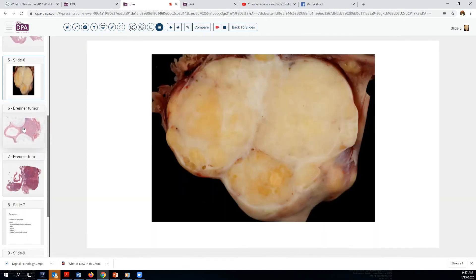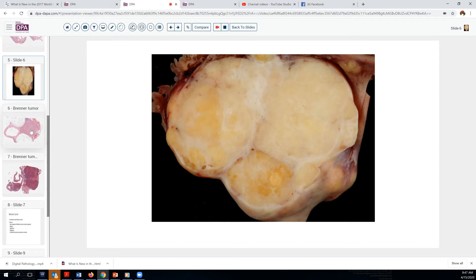Let's look at a gross image of these tumors. Sometimes here we see they have a lobulated appearance, with a variable white and yellow appearance. The yellow sometimes is indicative that there's hormone production in the thecomatous stroma.